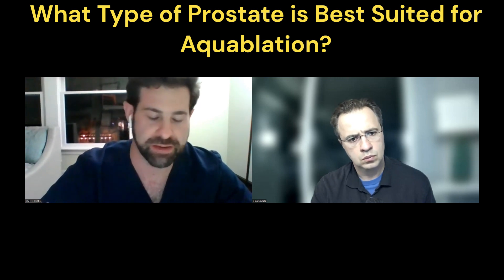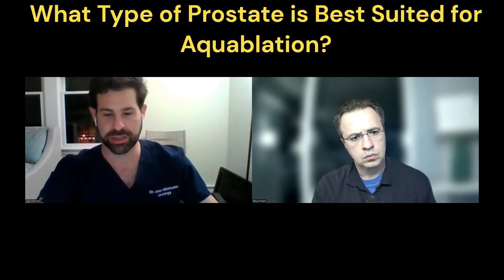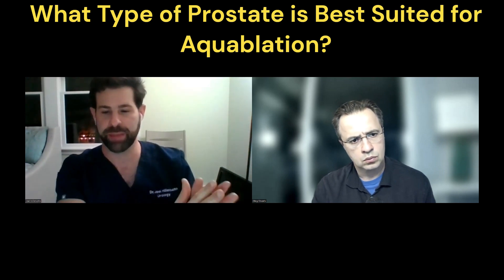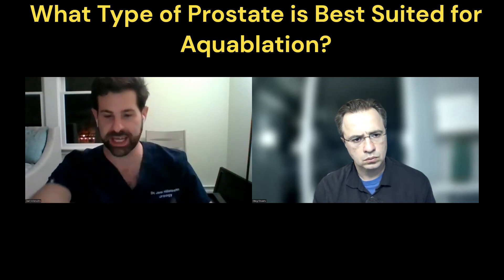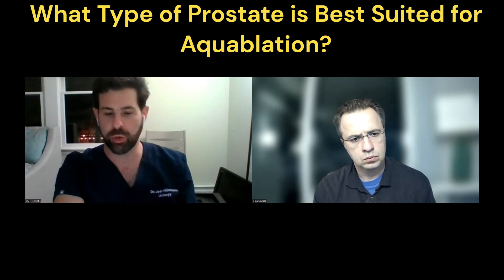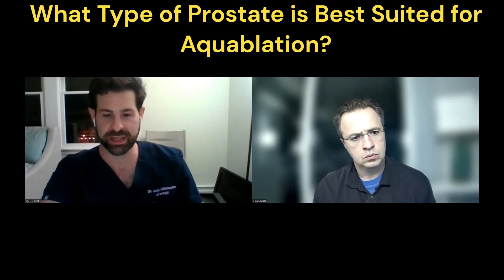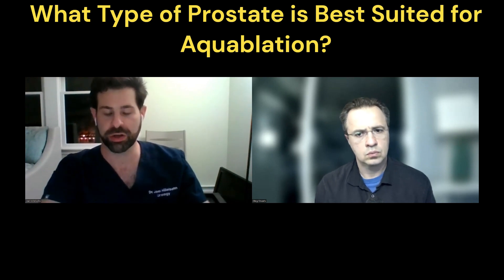If there's a very significant median lobe, what I do is often go and do the roto-rooter first. Think of a power washer — there has to be a surface that gives back tension on it. If the median lobe has the prostate going to the bottom and it's just hanging there, there's nothing for the water to work against; it will just bounce off and won't remove a significant amount of tissue. So that tissue I tend to eliminate in the beginning, so the whole procedure goes smoother.